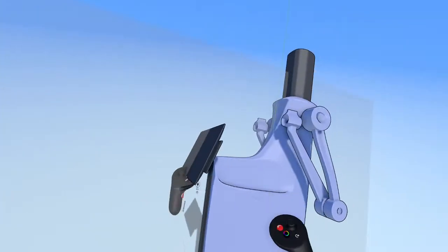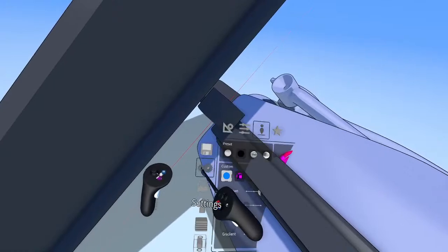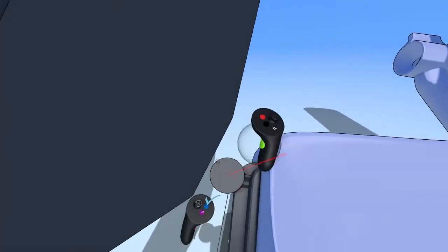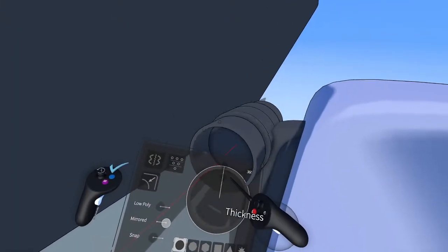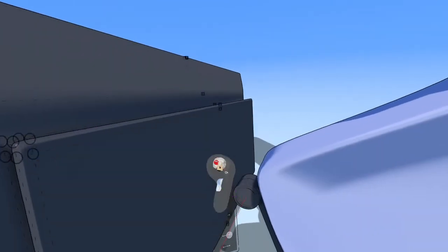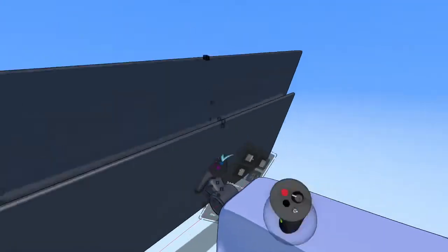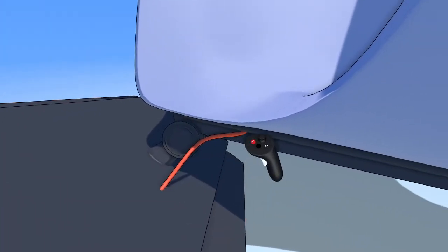Okay. And then we can use the revolve tool here to just drop in. Oh, sorry, because I restarted it, I have mirror turned off again. So I had to turn that on. All right, and just to add a little bit of detail as well, we can come in here and just use the stroke tool to add some wire detail.